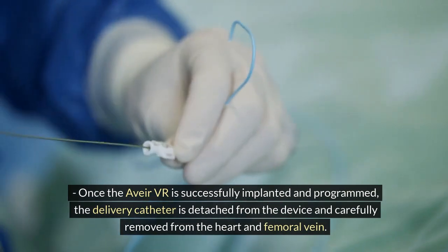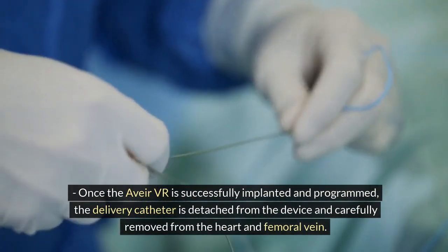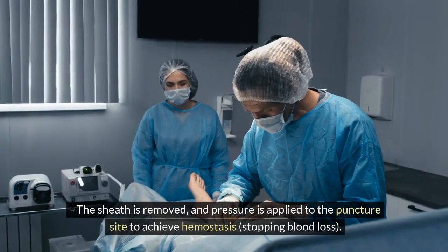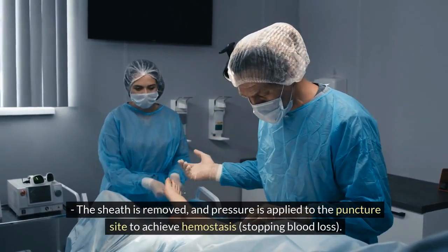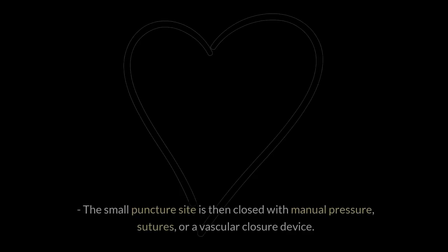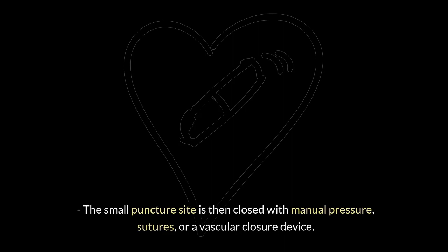Step 6: Catheter removal and closure — once the Aveir VR is successfully implanted and programmed, the delivery catheter is detached from the device and carefully removed from the heart and femoral vein. The sheath is removed and pressure is applied to the puncture site to achieve hemostasis, stopping blood loss. The small puncture site is then closed with manual pressure, sutures, or a vascular closure device.